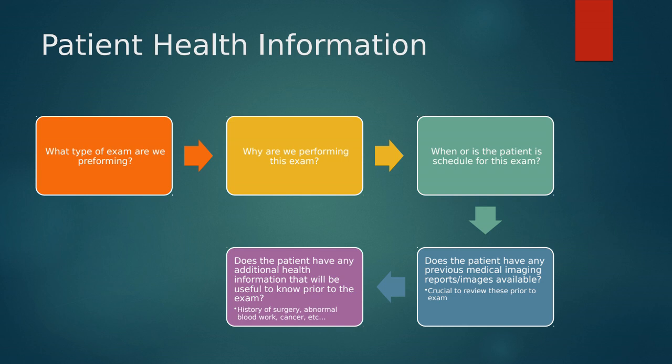It's very, very important for us, especially to be reviewing images if we have them. And if we don't have them, it's important for us to understand the terminology that we can find on a previous report. A lot of patients will come to us as a follow-up from mammogram or as a follow-up from MRI, where they see something on those exams, but they need further detail. And ultrasound can provide that detail. But if you're not aware of what T2 or T1 means on MR, then it's not really going to help you that much.